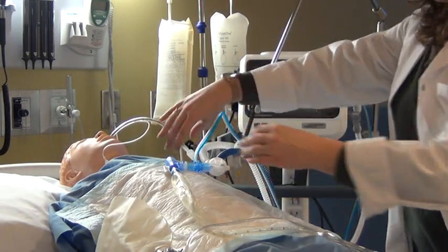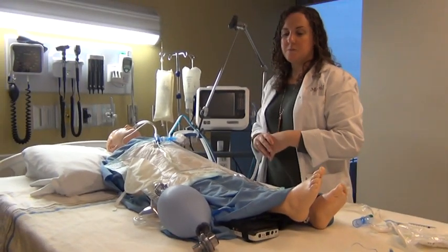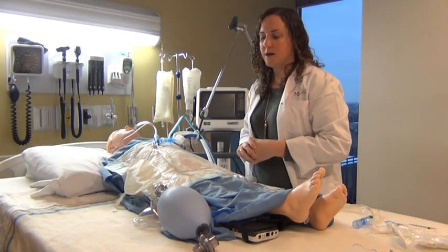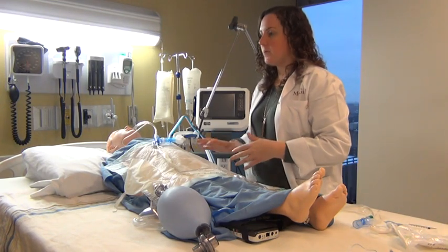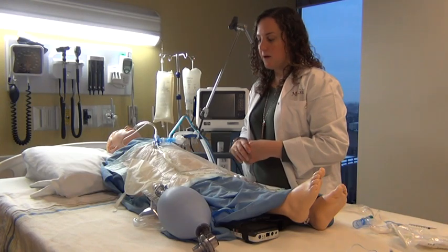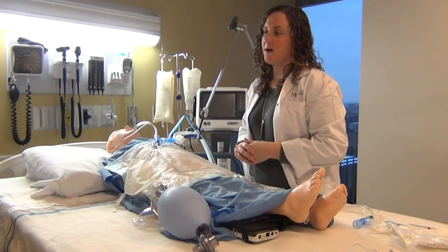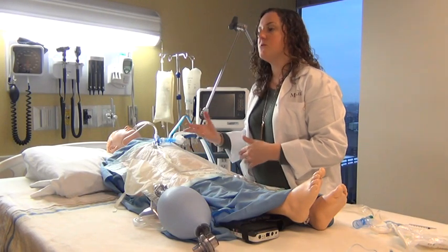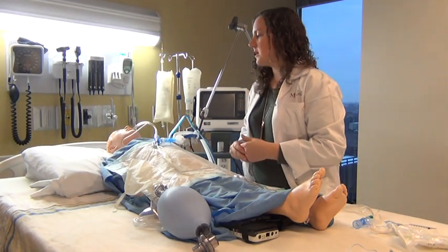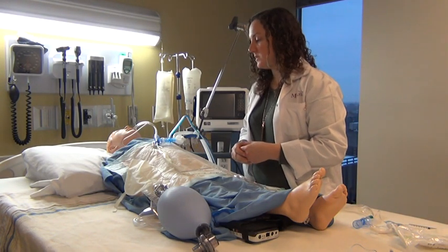So that's some of the responsibilities as a nurse when it comes to caring for these patients: mouth care, ensuring that the airway is protected and safe, and also suctioning is a big responsibility. Also comes with that is communicating with your patients. Having an endotracheal tube, they cannot speak. Therefore, you need to find different strategies to be able to communicate with these patients.